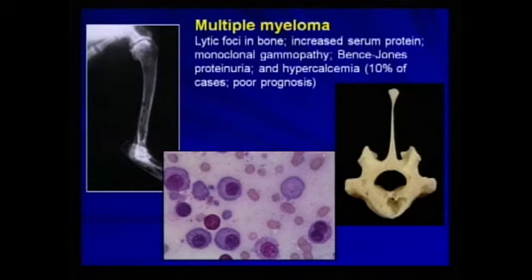And then the aspirates of these have the features that we expect with the deeply blue cytoplasm, the individualized round cells, and on the right we see a binucleated cell. Okay, these cases generally have other clinical pathologic abnormalities with a monoclonal gammopathy, loss of these monoclonal Bence-Jones proteins, increased serum proteins because of the liberation of all of those light chains, and often hypercalcemia.